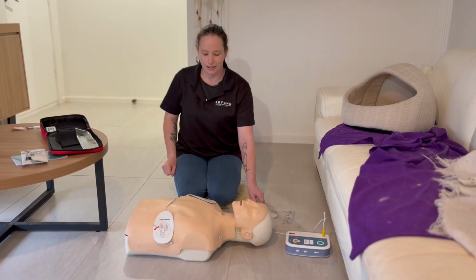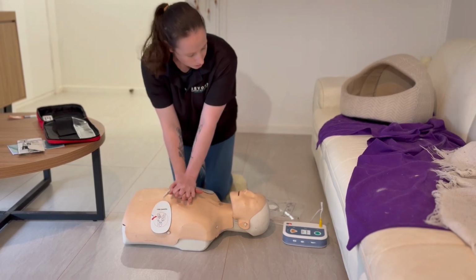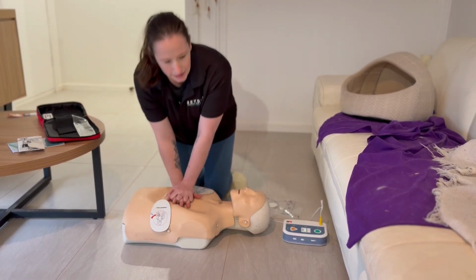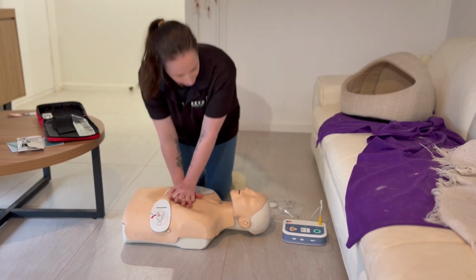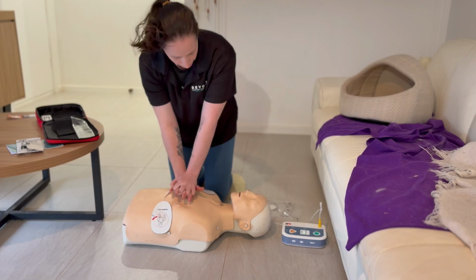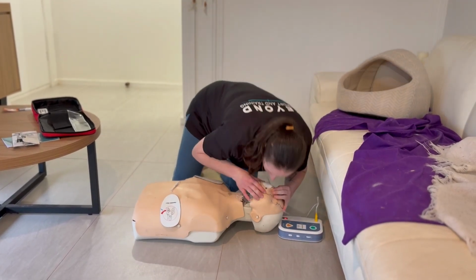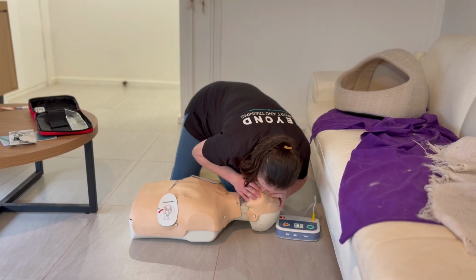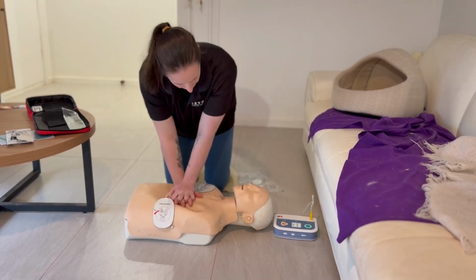Start CPR. The beats of the AED are going to keep you in rhythm. You can also look at the lights on the AED. You're going to do your 30 compressions to 2 breaths, and you're going to do this for 2 minutes.